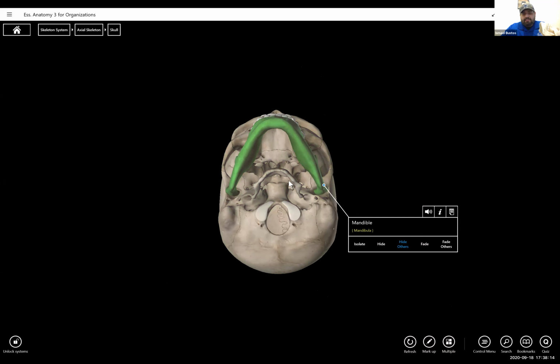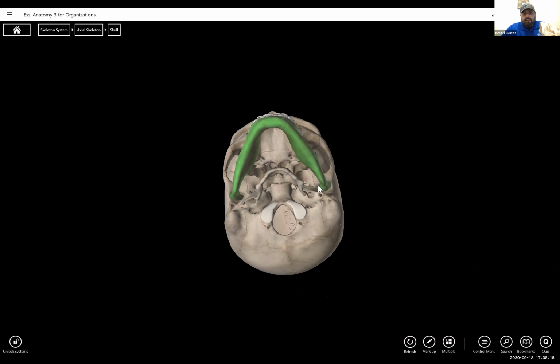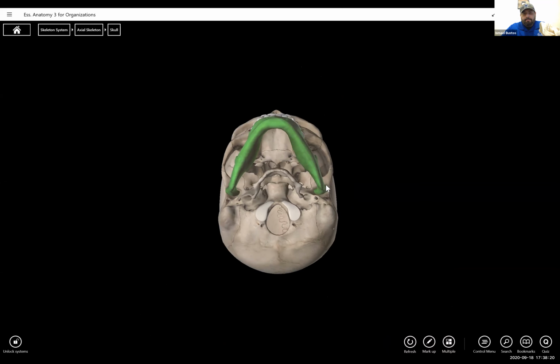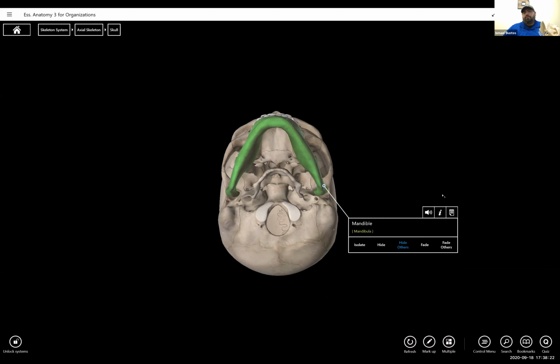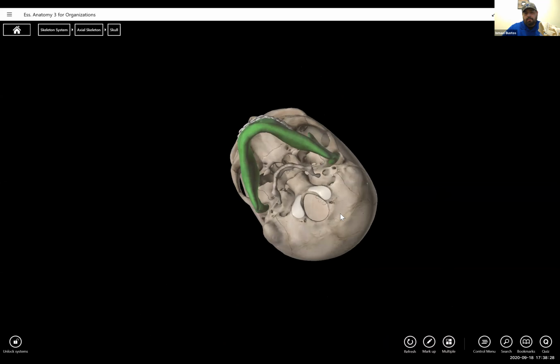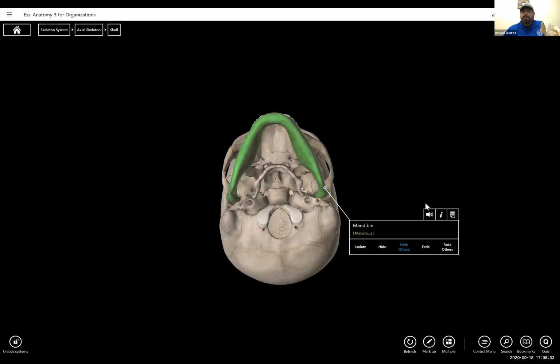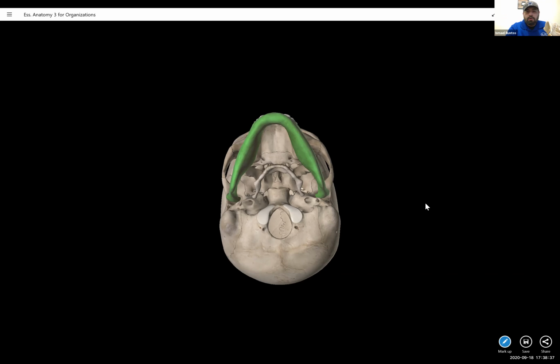We want to see this skull kind of like that. So that's how the SMV should look. I can't turn it around, but we want the CR to enter... Let me get this a little bit more straight, sorry.